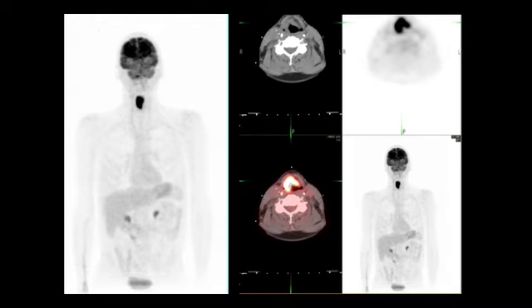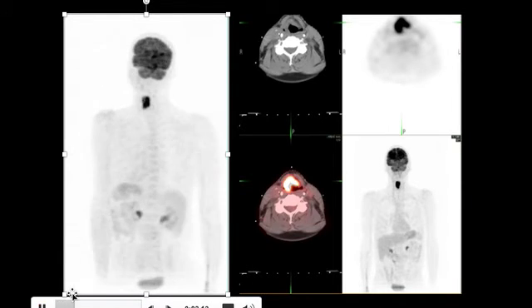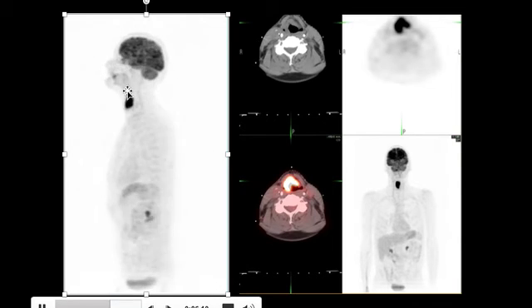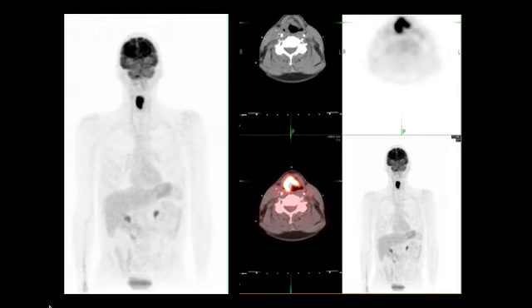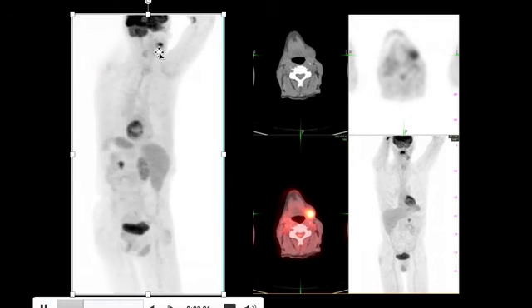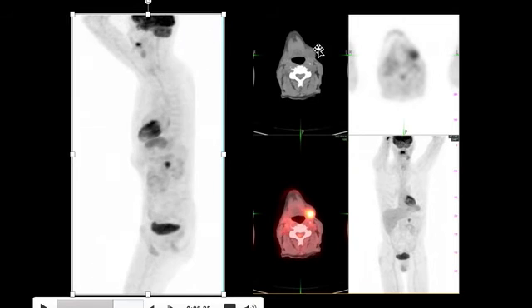I have a companion case for you. Here is a patient with history of laryngeal cancer, and we can see there is focal hypermetabolism that corresponds to soft tissue thickening. This patient underwent surgery and radiation therapy, and on their follow-up PET-CT scan there is a focus of mild uptake involving the left submandibular region. This focus corresponds to an enlarged left submandibular gland seen on the CT and on the fused PET-CT image.